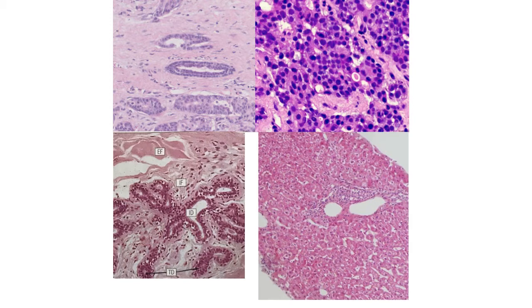Next, we look at a photomicrograph of abnormal breast tissue. You can see irregular lobular architecture. So you would normally expect to see just double layers, but they're starting to lose their architecture.